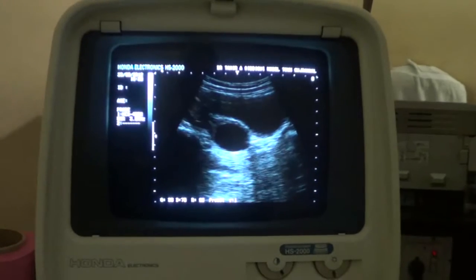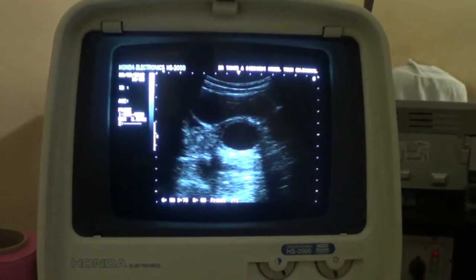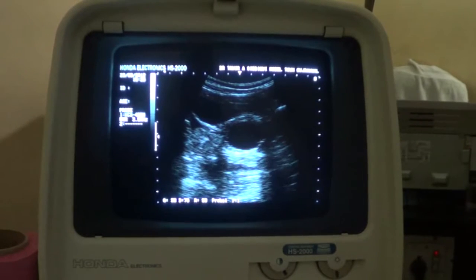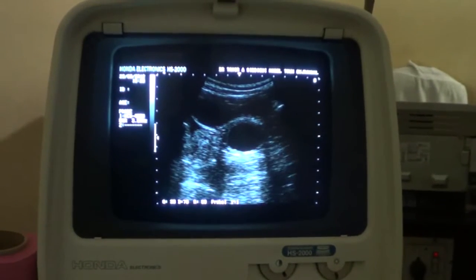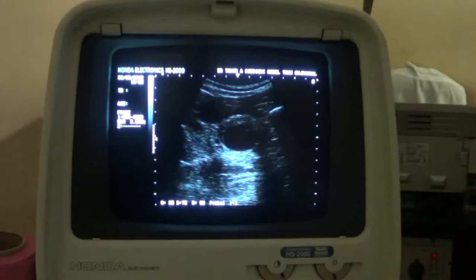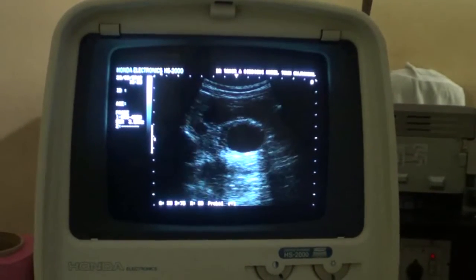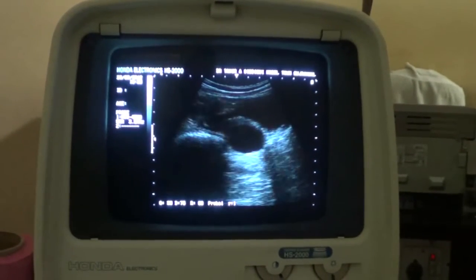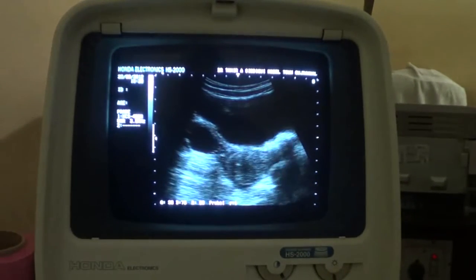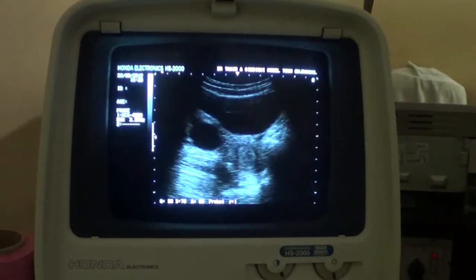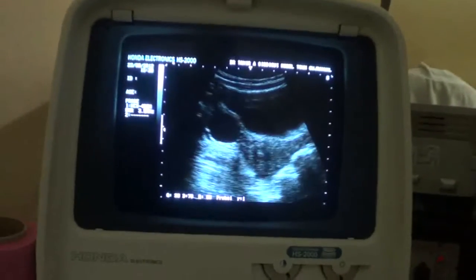Now I am moving the probe to see if the cyst changes in shape or remains the same. It has moved toward the left side and no change is seen in its shape. Cysts always maintain their shape. This is a follicular cyst with the uterus in mid-cycle.